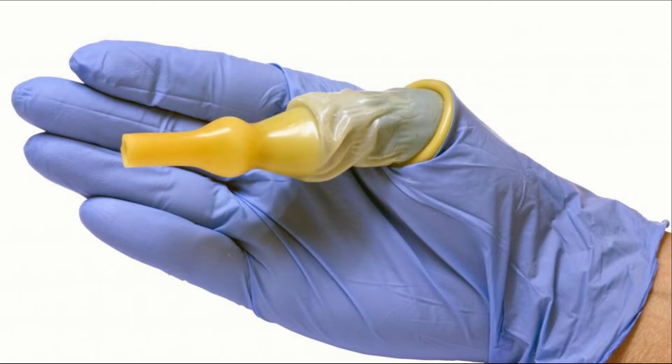A condom catheter is a male urinary incontinence device consisting of a flexible sheath that fits over the penis just like a condom. The condom part is then attached to a tube that drains the urine into a urinary storage bag.